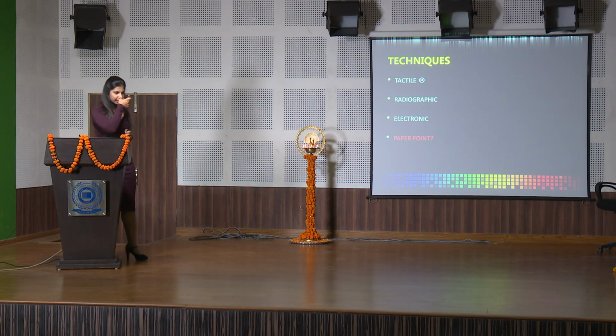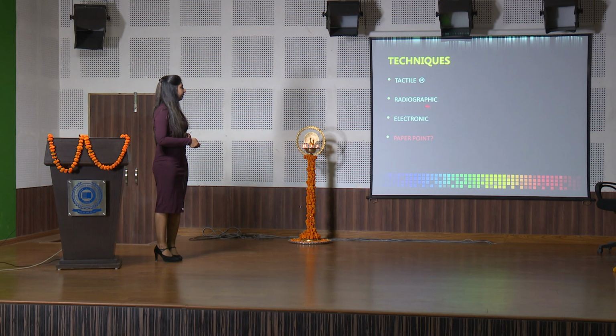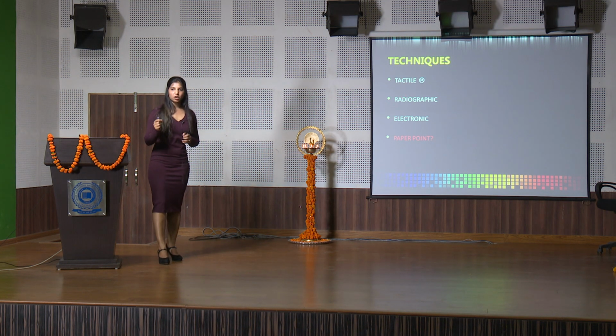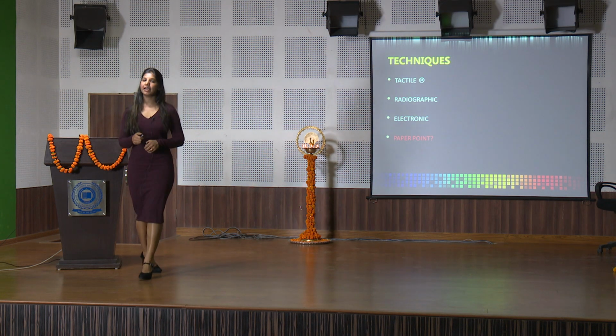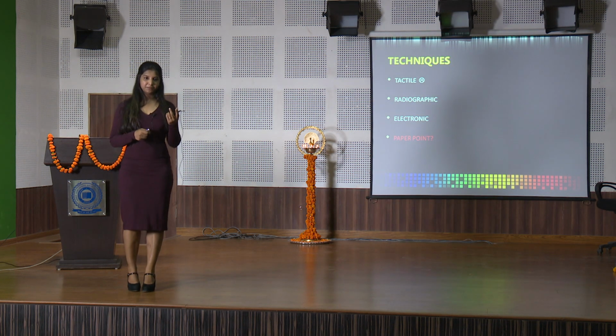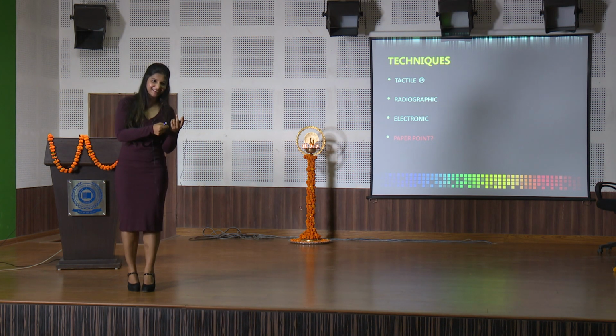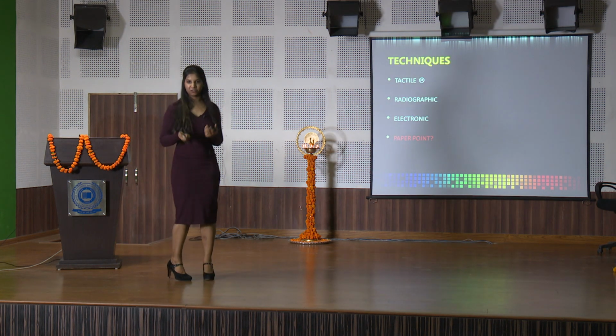There are various techniques for working length determination, namely tactile, radiographic, electronic, and paper point. We'll talk about them in brief one by one. Number one is tactile. I call it the sadistic approach. Open the pulp chamber, put the file into the canal and ask the patient, "Is it paining? Did it pain?" So this is a sadistic approach of determining whether the apex has been reached or not.